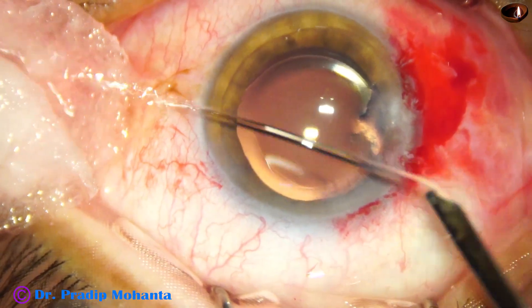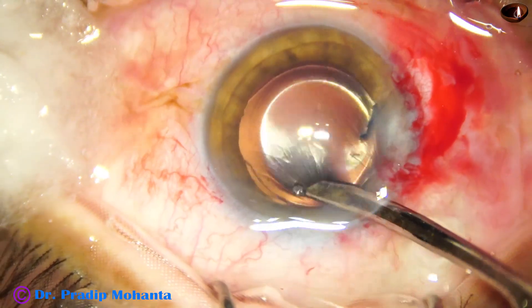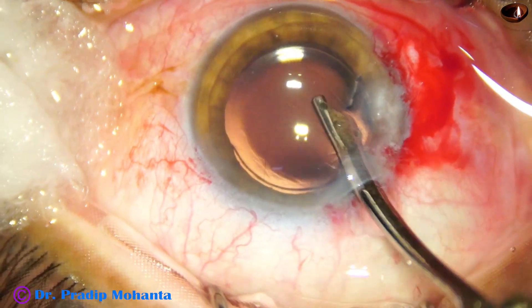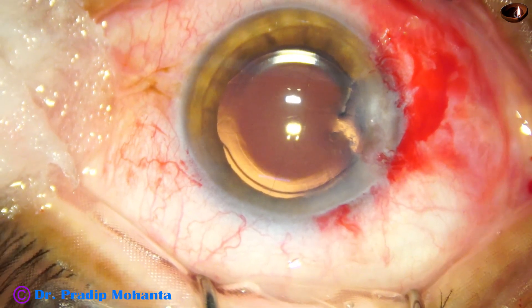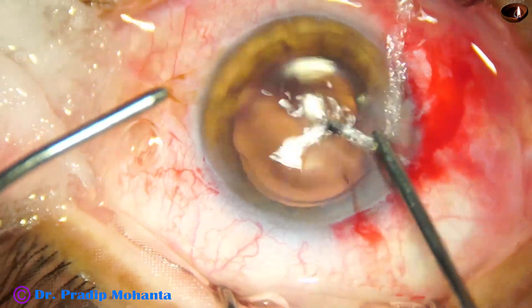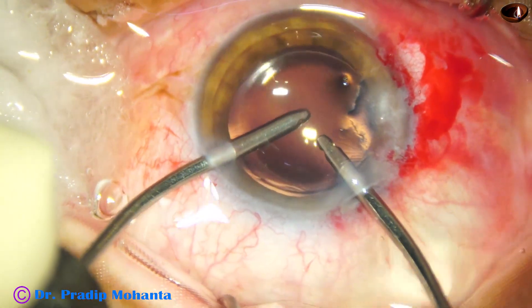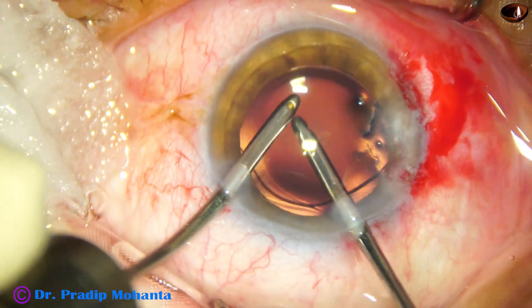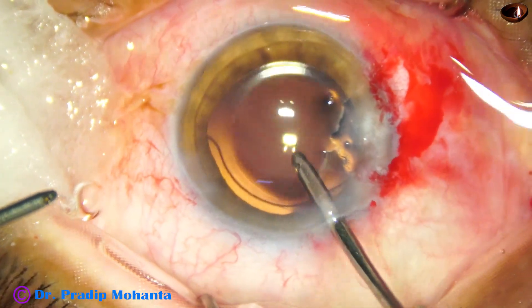Now this is cleaning of the visco. You may ask why I did not inject visco and then put the intraocular lens — the reason is the visco is on the anterior aspect, so cleaning is easier and takes less time. If there is visco behind the lens it takes longer. So I did hydro-implantation, then placed some viscoelastic substance above the lens, and cleaning is done easily.